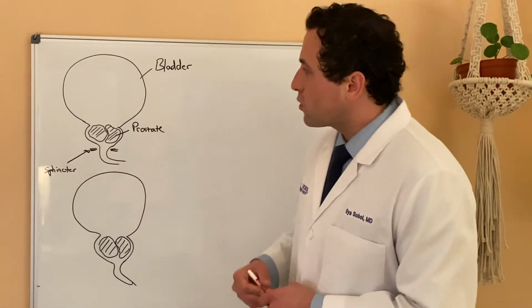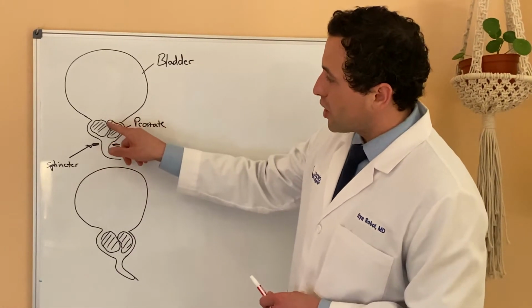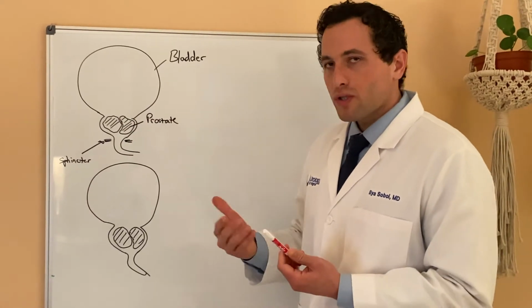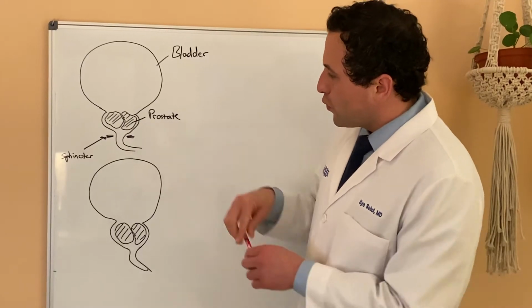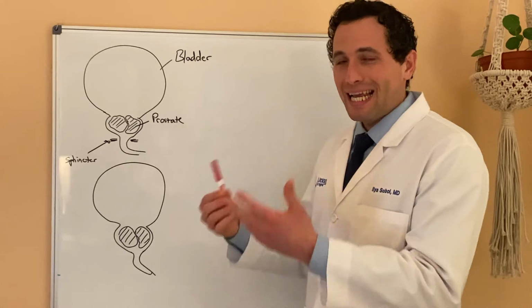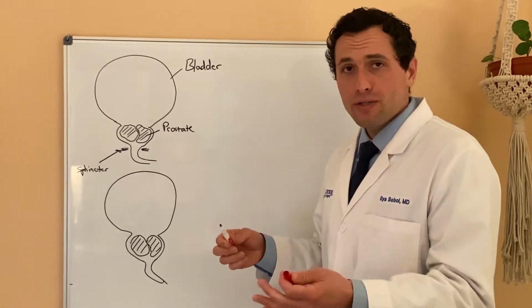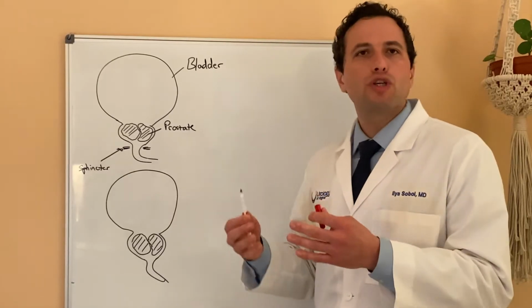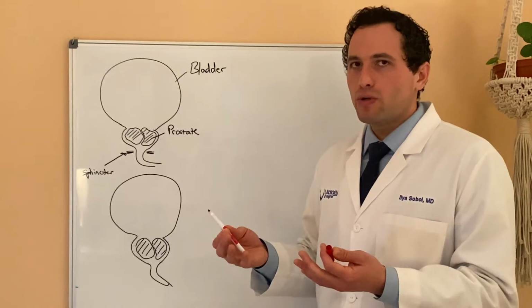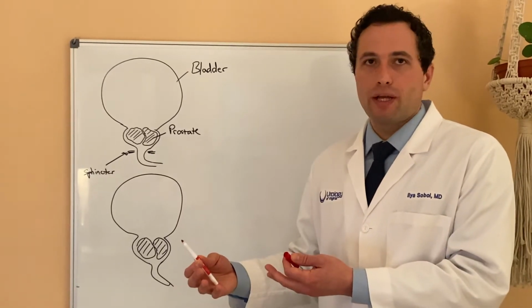So again, if we're looking here, bladder, prostate, and then sphincter muscle here. This is the channel that you pee through in the prostate. The way a TURP works is that we're going through the urethra tube. So this is a natural entry. We're not making any cuts on your body. And we're using some sort of energy source, whether it's a laser, and I think a lot of folks have some confusion about lasers or this energy or that energy. It's not really important what energy is used. What's important is what the disease is and how much of the disease you're removing, and how you're doing that.